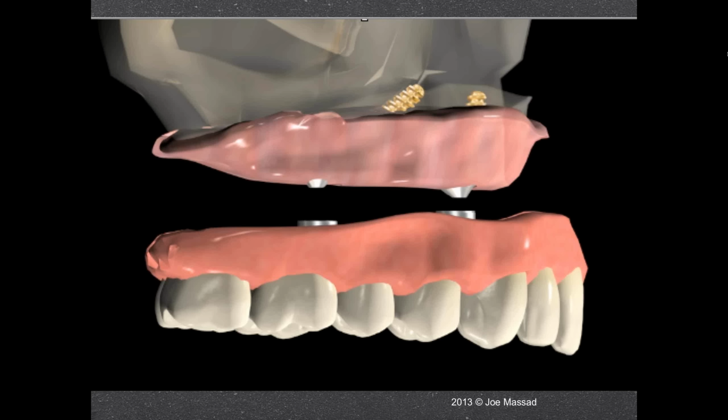And then we got on to doing what they call the All-on-4. Now there's another system very similar called SmartFit. These basic systems were utilizing 4 implants to put in a fixed prosthesis. Boy, how important is it to have an absolute, as perfect as possible, model? If we're off 22 microns, it's not going to fit well. We'll put torque on the implant, or we'll have to tighten that in. And in these cases the metal is generally one piece. We go right into the implant and the abutment is actually skipped.